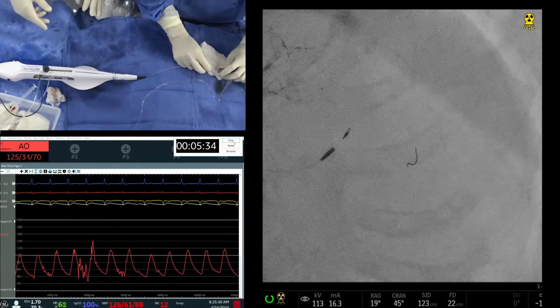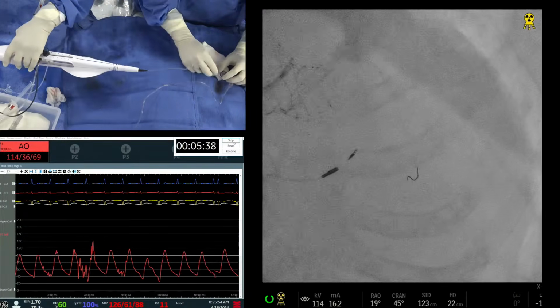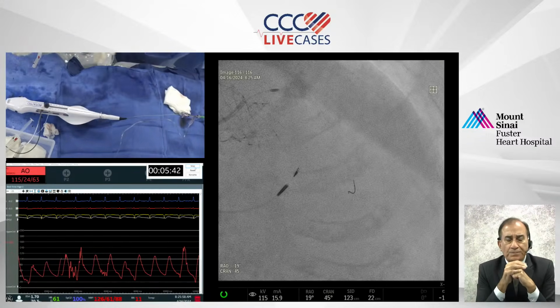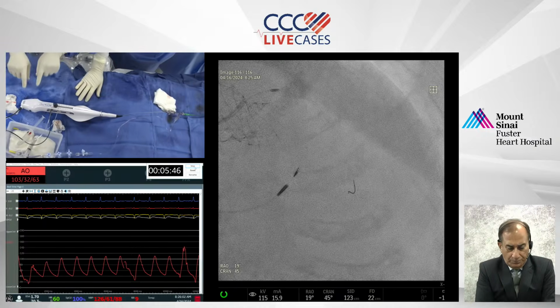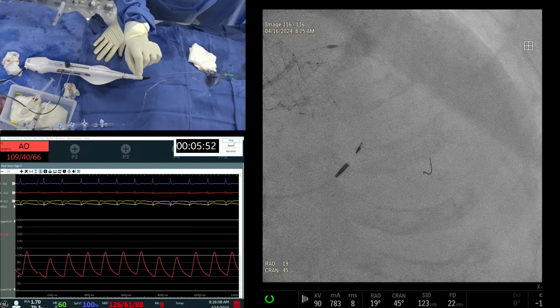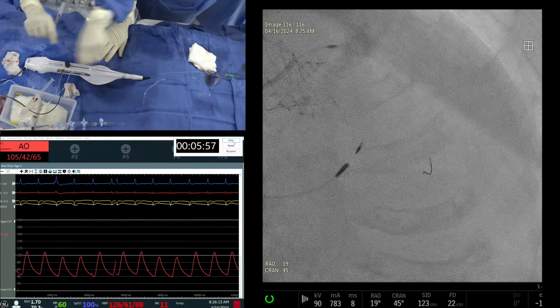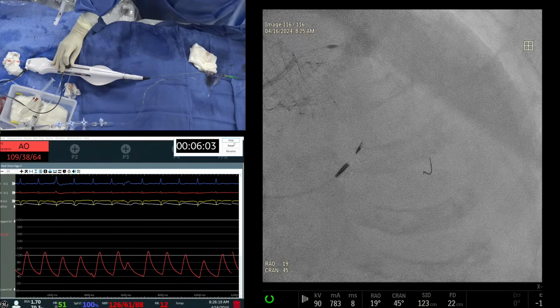The way the guiding catheter has been bobbing back and forth, is there a significant issue there? No, that's the way it behaves. You saw that by pressing the dynaglide and brake release, we advanced the burr into the left main. So rather than push and pull, with the guide coming out, you just advance forward. And we are ready now.